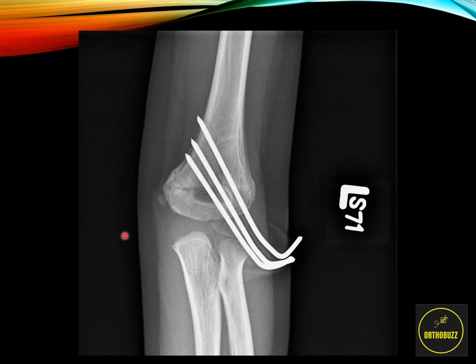And in the operating theatre, this is an example of what may happen. What we do is reduction, getting the bones back in the correct alignment, and then pinning them there with K-wires, which will come out several weeks later once the fracture is healed. The patient will then be placed in a cast after having this K-wiring done, and will be followed up in the clinic to ensure that the fracture is healing correctly.